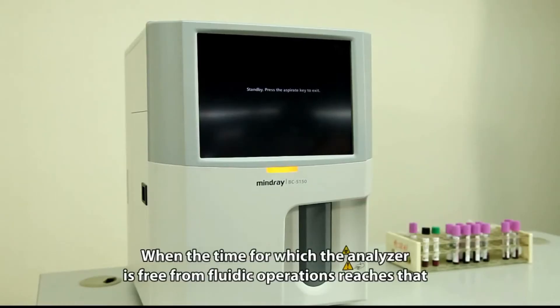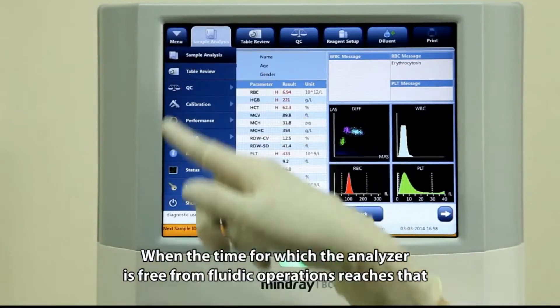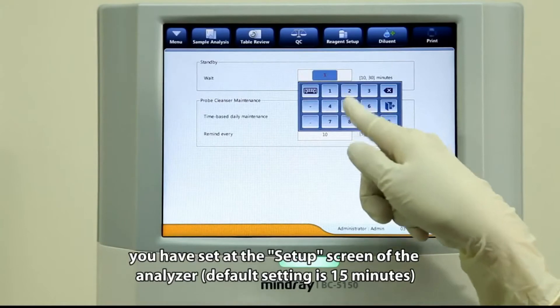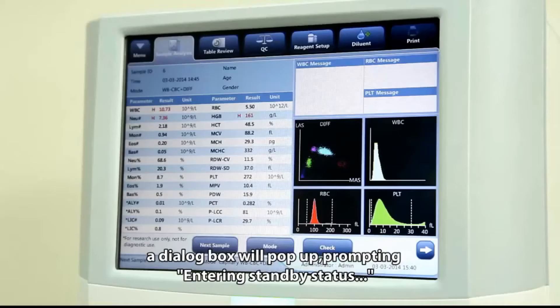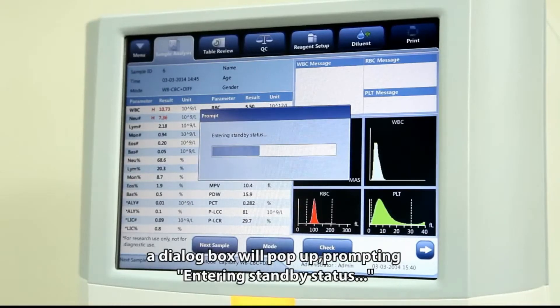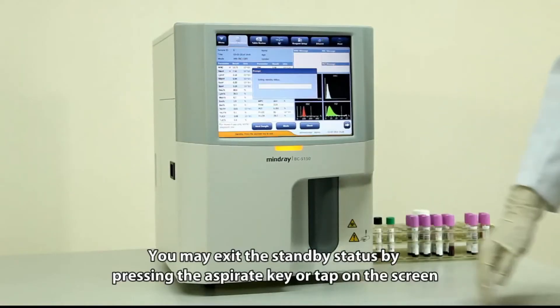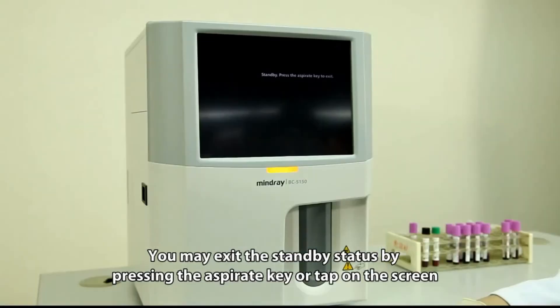When the time for which the analyzer is free from fluidic operations reaches the duration you have set at the setup screen, a dialog box will pop up prompting entry into standby status. The default setting is 15 minutes. You may exit standby status by pressing the aspirate key or tapping the screen.